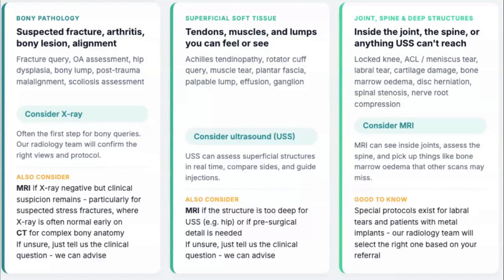The other thing the ultrasound is very good at, and we use it for, is to differentiate cystic lesions from solid lesions. If something is a cyst, a fluid-containing cavity, it's nothing to worry about. You can reassure the patient that it's just a simple cyst. Other soft tissue conditions that we use ultrasound for are things like plantar fasciitis at the ankle, around the plantar fascia. As you get older, like I do, you get plantar fascia pain, and you can diagnose that. Look at fluid and so on.